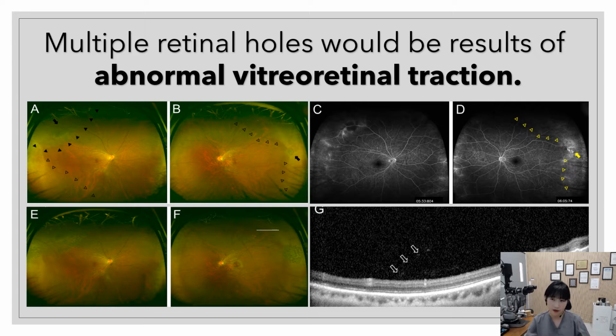At first, I thought that it was a retinal vasculitis, but there was no evidence of inflammatory reactions in either vitreous or retina. So I tried to get an OCT scan in these areas, but it was not easy to get an OCT image on peripheral retina. After repetitive trials, I could get an image that suggests vitreoretinal traction in this patient.